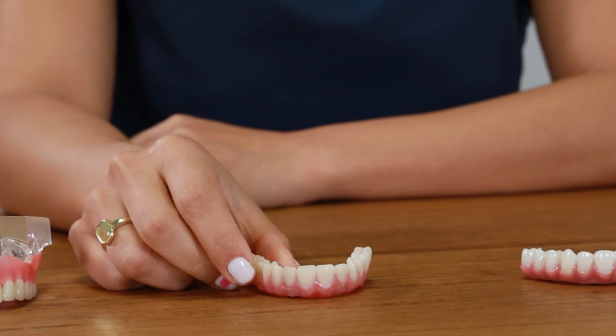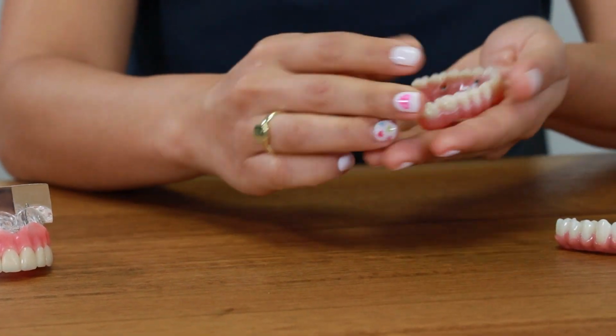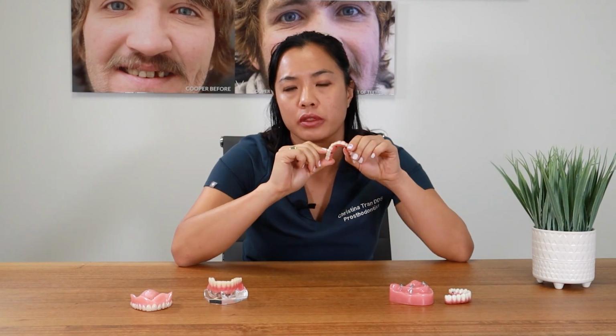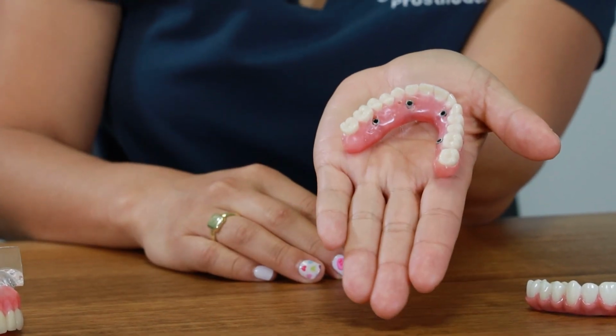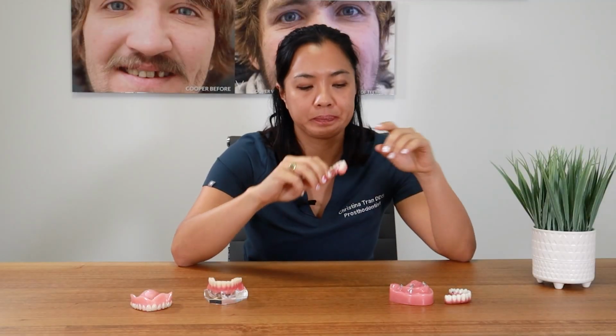The next type of prosthesis is fixed in your mouth. It's screwed into the implants, and you cannot remove it at home. Only a dentist can remove it. There are different materials available. This is an acrylic-based one. The denture teeth are made with reinforced acrylic. And this is a fine material. It's been used for a long time.